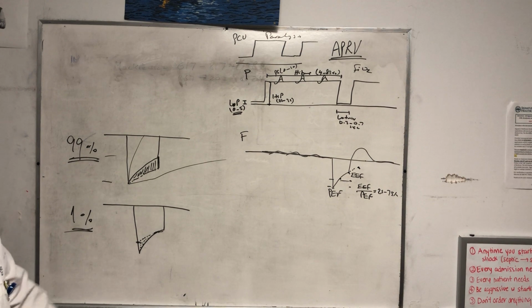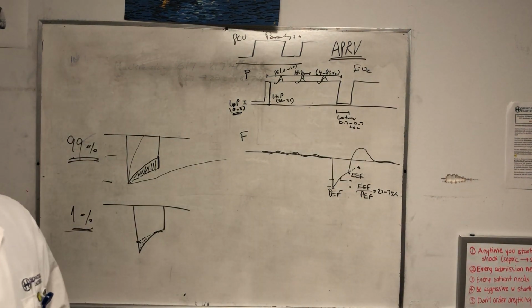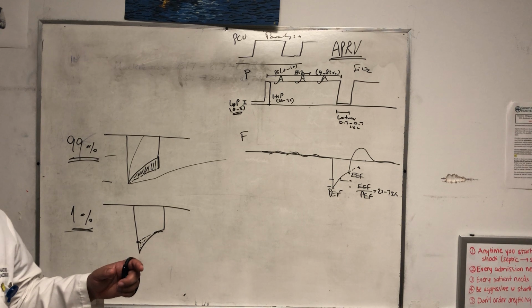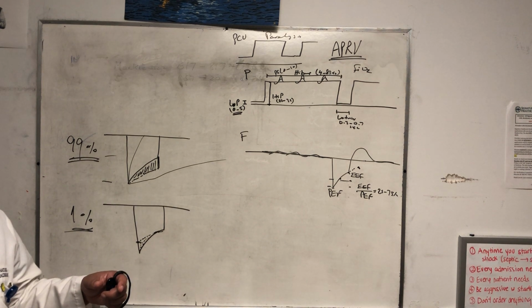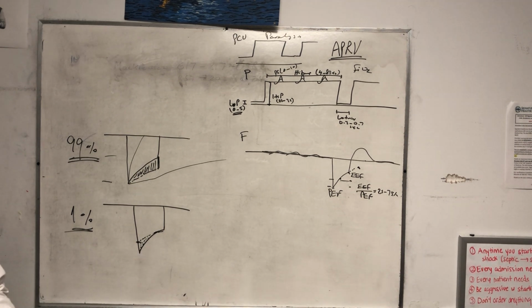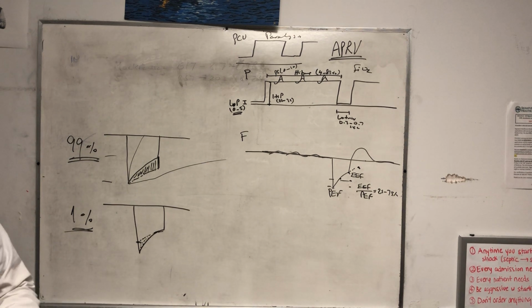If you put the patient on a regular setting, 0.3 to 0.7 low time, and you see that the ratio is 80%, that means you need to prolong the time. So you prolong the time, make it 0.7, 0.8, 0.9, max is 0.9 for this. Once you reach 0.9 and the ratio is still high, like 70 or 72, close to the 75, right?